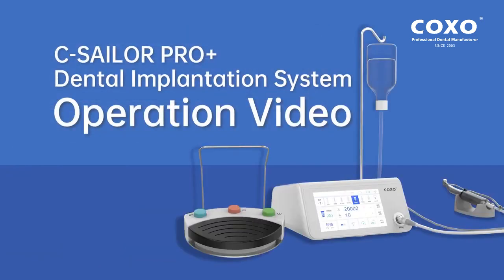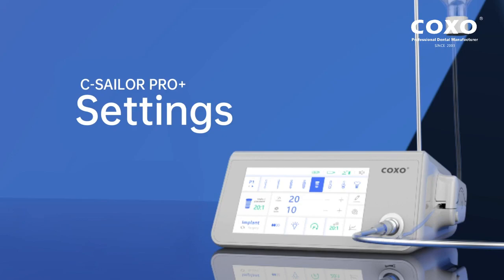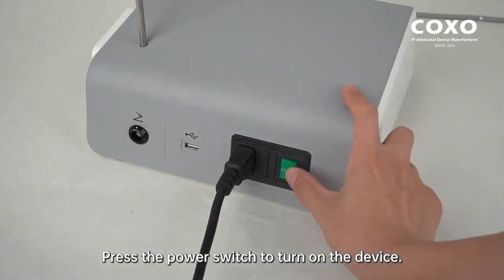C-Sailor Pro Plus Dental Implantation System Operation Video: Settings. Press the power switch to turn on the device.